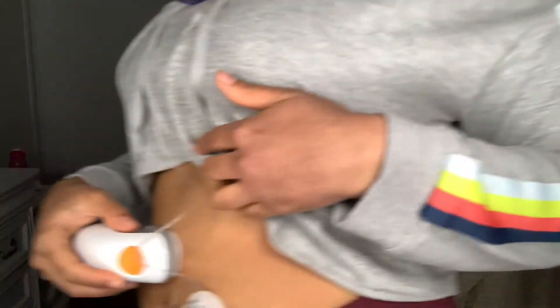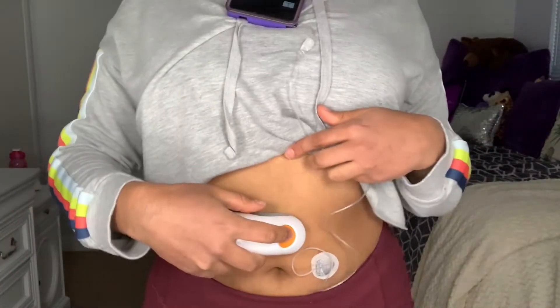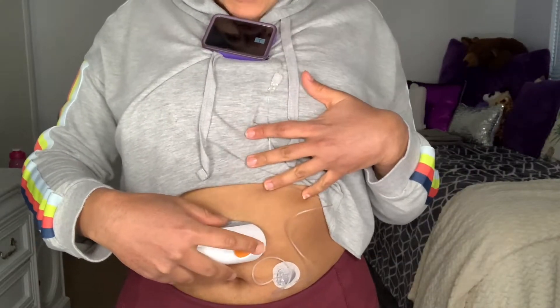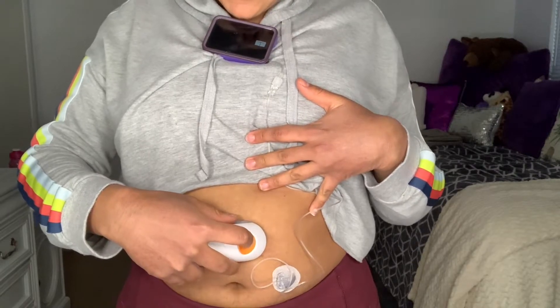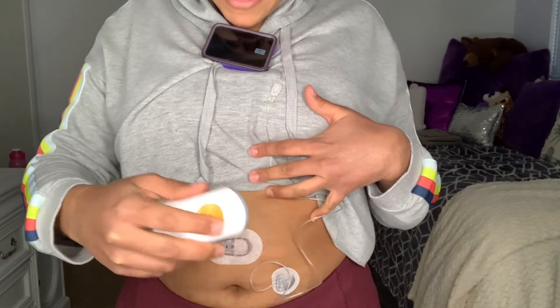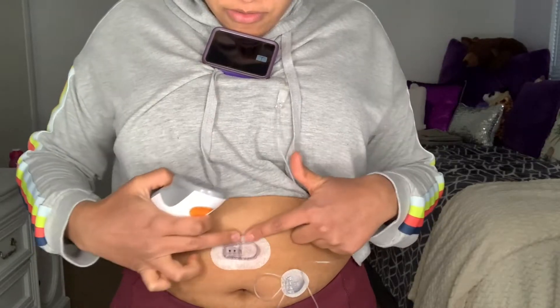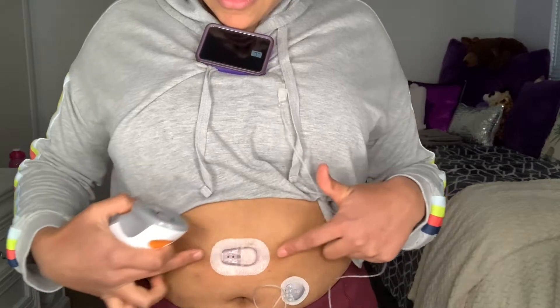As you can see right here, it's attached to my skin, but we need the sensor to go in to my skin — that's what this button does. So just lightly hold it there and press that button. You're going to hear that sound and now it's attached. Just lightly go over it and make sure it's sticking down.